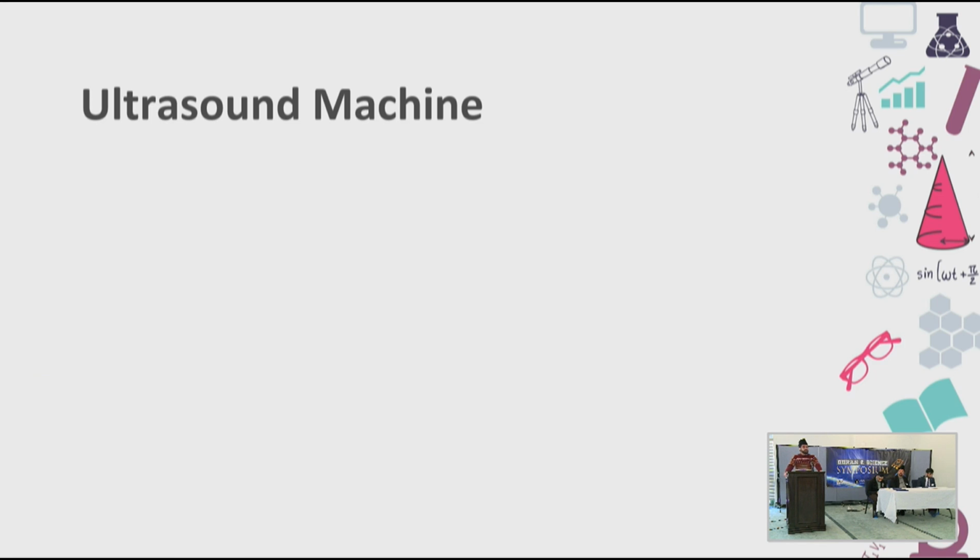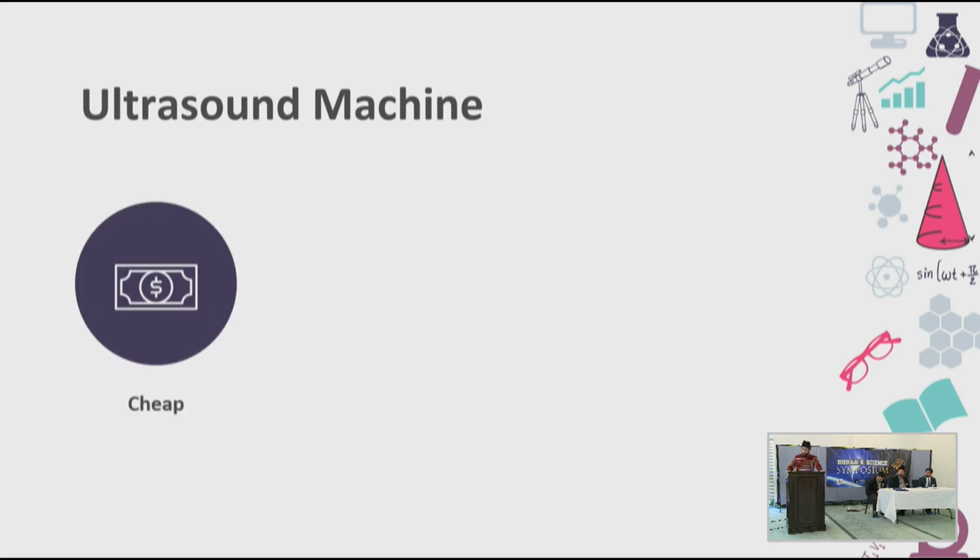Currently, liver biopsy is the gold standard for identifying non-alcoholic fatty liver disease. Liver biopsy is invasive in nature. It has complications such as bleeding included with it. My research primarily uses an ultrasound machine. It has more advantages than a liver biopsy.